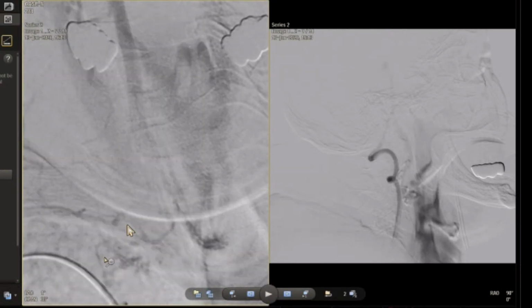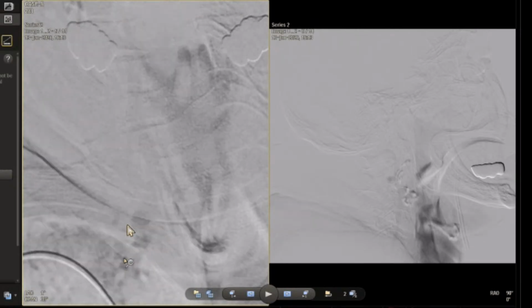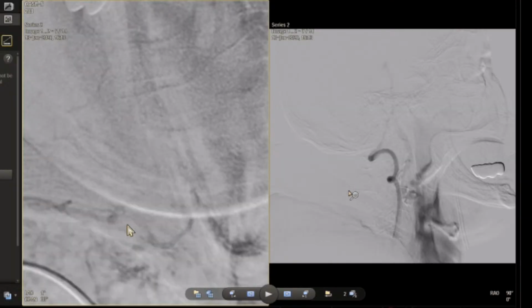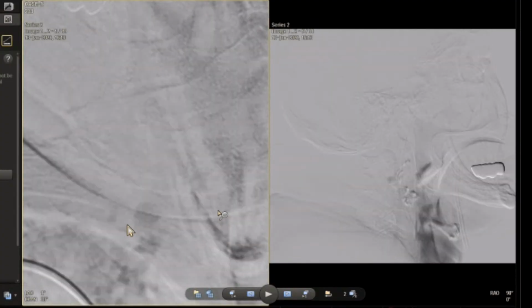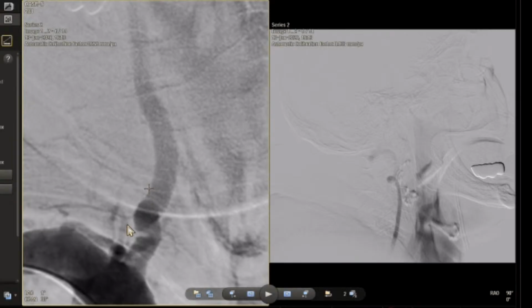Yes, my name is Mynzhylky Berdikhojayev, and my assistant is Ravan Maratolu Ayteli. This should be non-significant. If it's significant, then the muscular collaterals should be very active. And I think it's a partially calcified plaque. Let's measure.